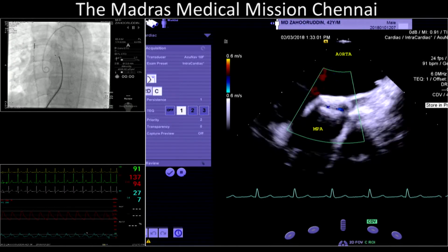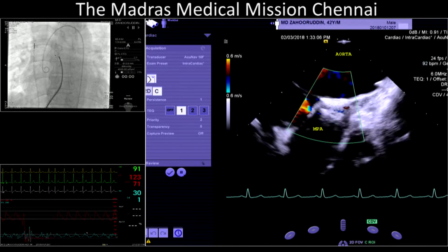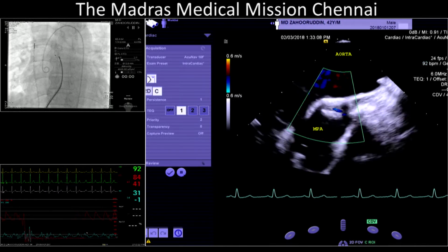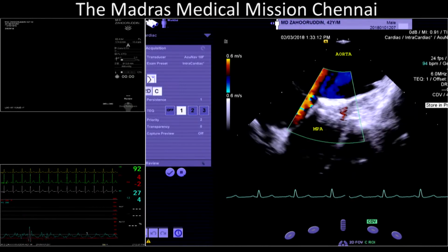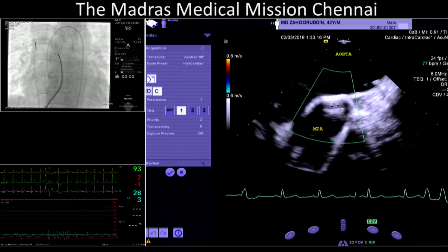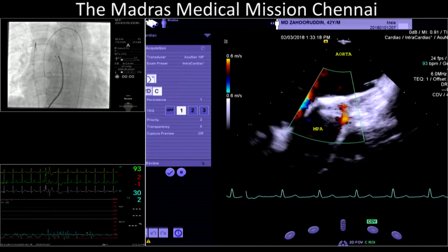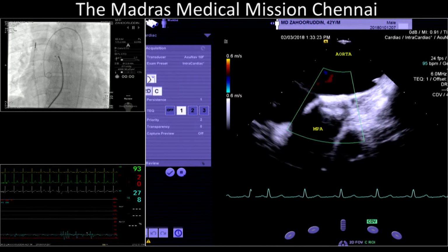From the aortic side, I will give you. No, I mean, before you release, you make an angiography, an aortic one, but you can even give contrast through the long sheath. I will do that, but very often there will be an overlap between the right pulmonary artery and the aorta, so we will not get a separation. I'll first give the aortic picture.